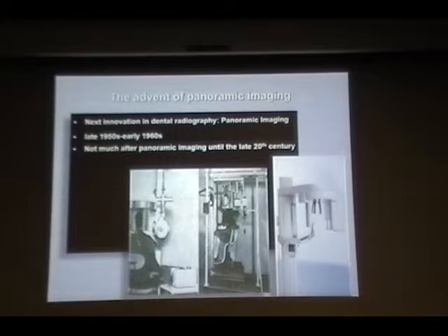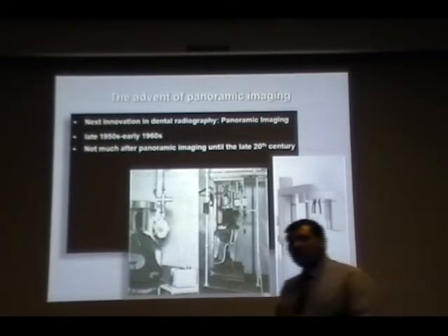And then, till the early part of 2000, we didn't see any advancements. Although tomography came, it never actually came into full commercial use.